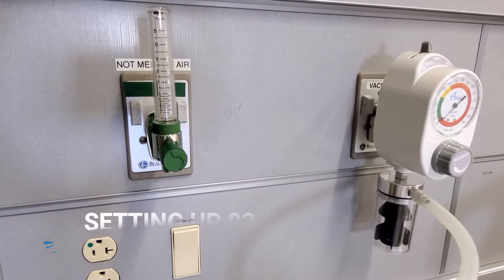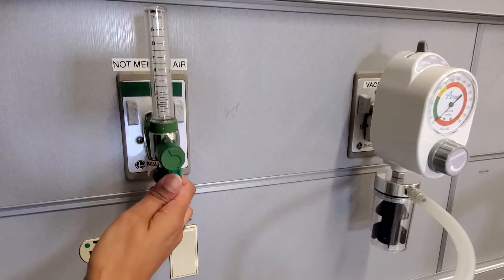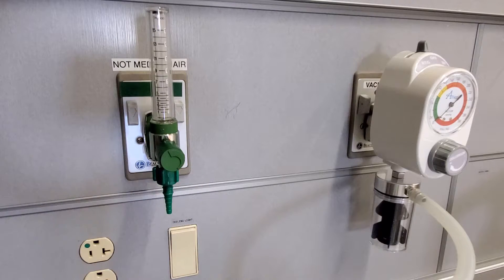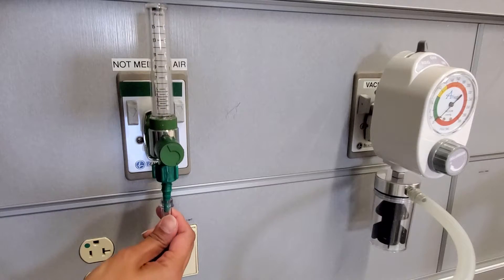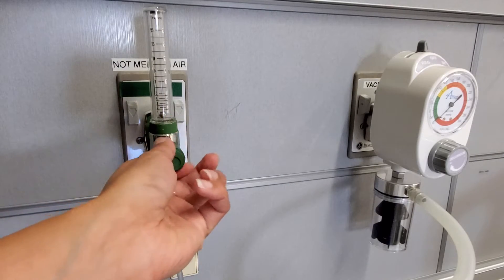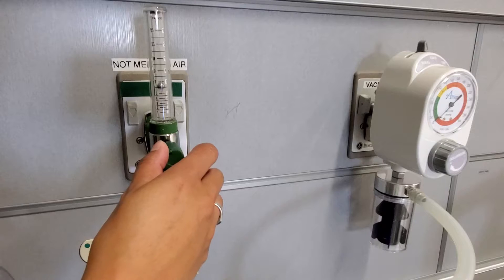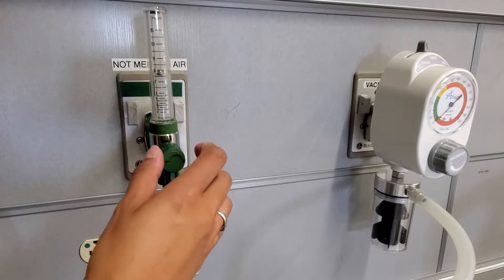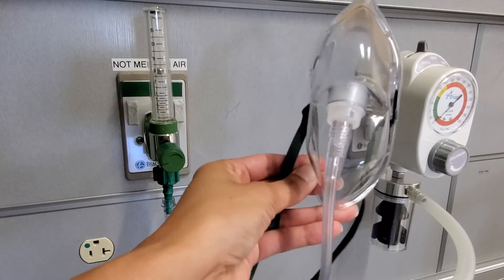To set up your oxygen, first get your Christmas tree and screw it onto the bottom, threading it all the way to the top. Then get your oxygen delivery device — this is a simple face mask with tubing — and attach the tubing to the green Christmas tree. Bring the silver ball up in the flow meter and make sure the middle of it lines up with the liters per minute you want to deliver. For example, if you want to deliver 9 liters per minute, set the silver ball there, and now you're ready to put the simple face mask on your patient.